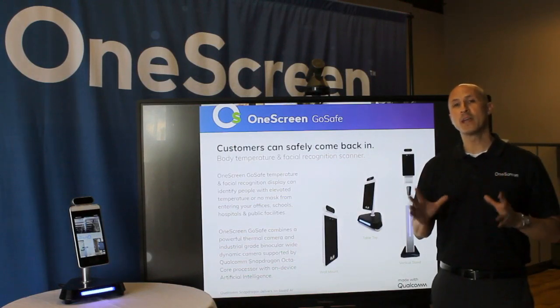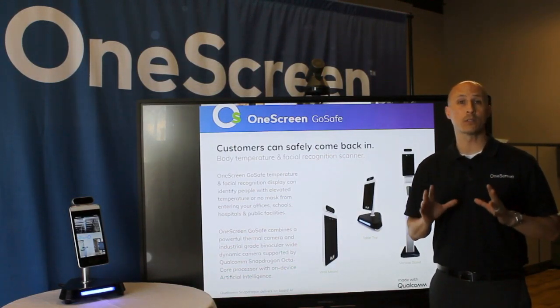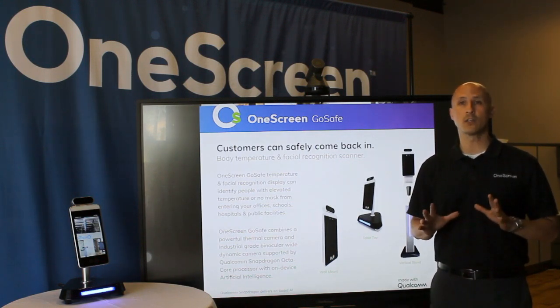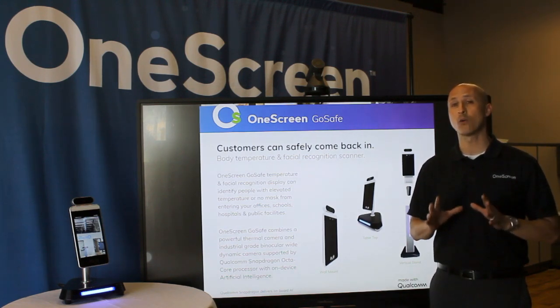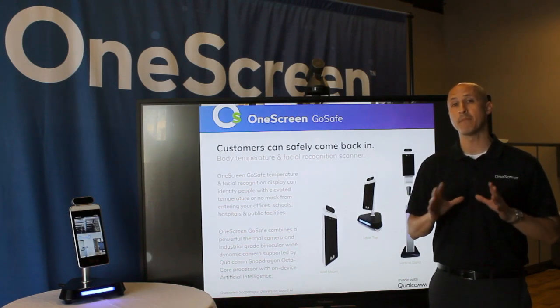Thanks for clicking in today. We at OneScreen are so excited to introduce our brand new OneScreen GoSafe body temperature and biometric scanner. The best part is OneScreen GoSafe is powered by American-made Qualcomm Snapdragon octa-core processor with onboard AI for the fastest and most secure biometric scanning.